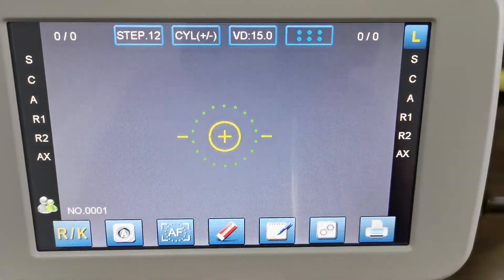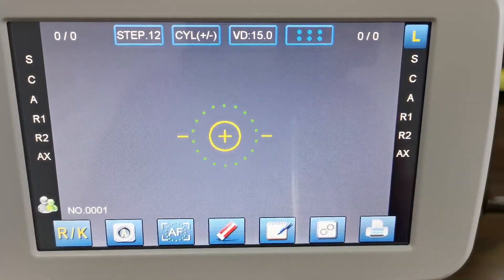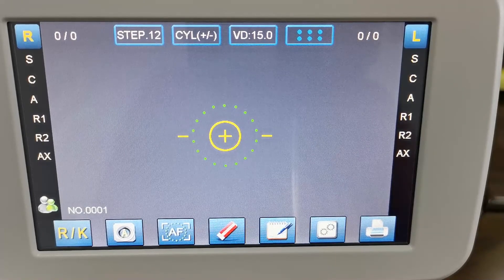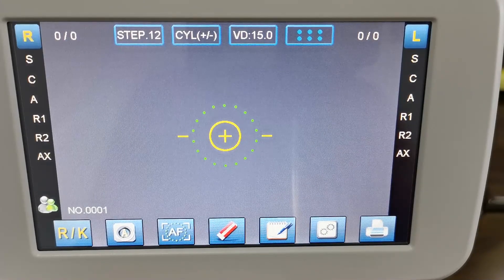All right, that's it for the illustration of the software interface for our autorefractometer.